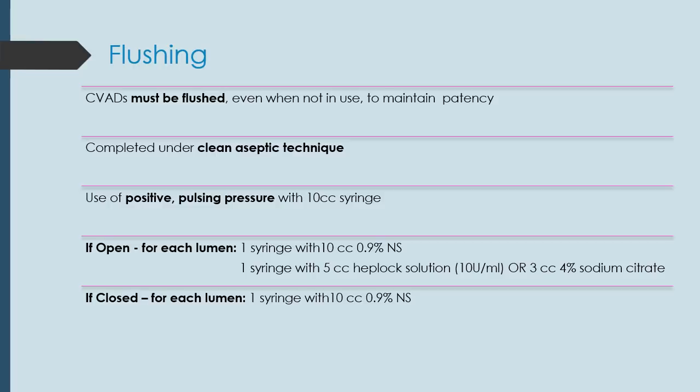But the general commonality between all types of central catheters is that you're always going to use a 10 ml syringe, never smaller. So if this is a question on an NCLEX exam, you're going to put in 10 mils. A 5 mil, a 3 mil, and I don't know why you'd ever consider it, but say a 1 mil, are too small. There's higher PSI on them, and they actually can cause the catheter itself to rupture inside the patient. This is why you're always going to use a 10 ml syringe.